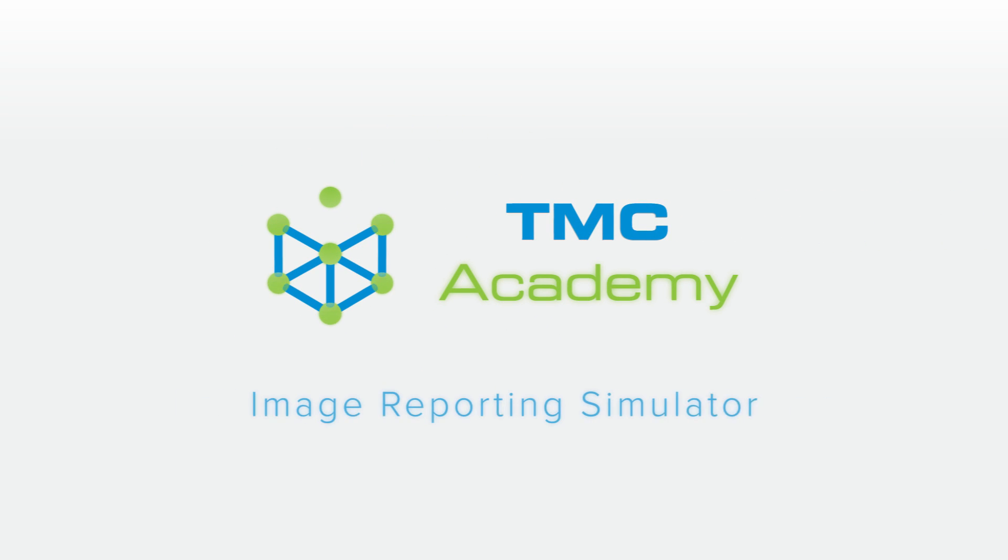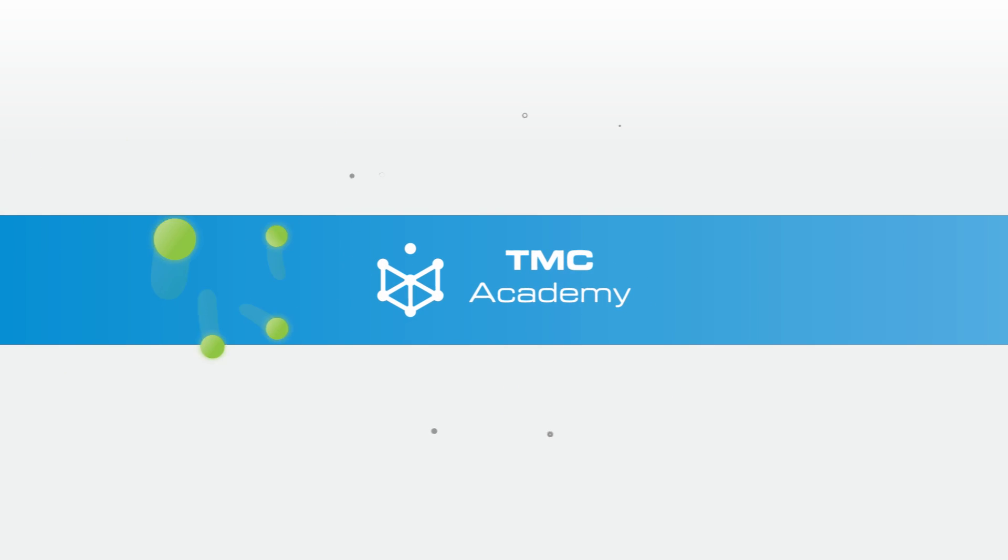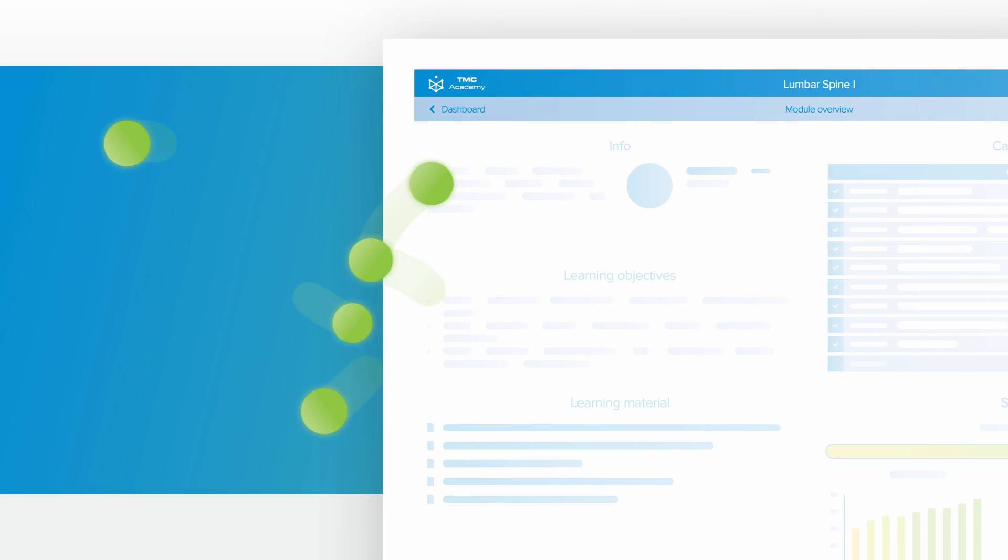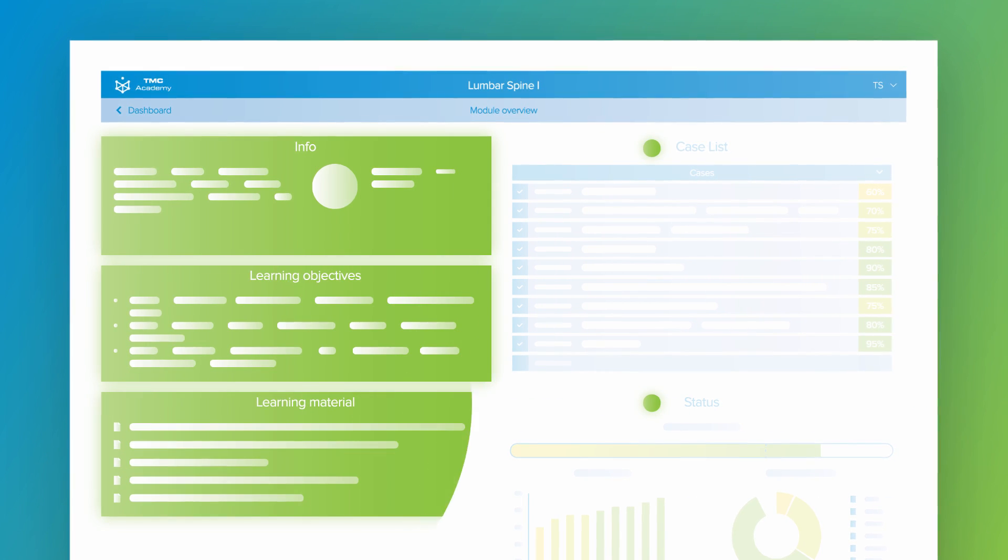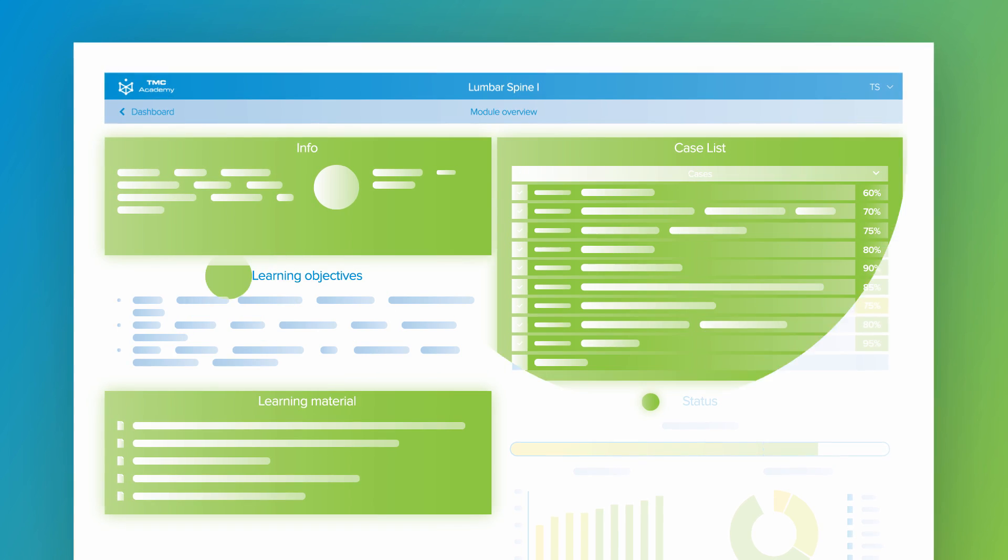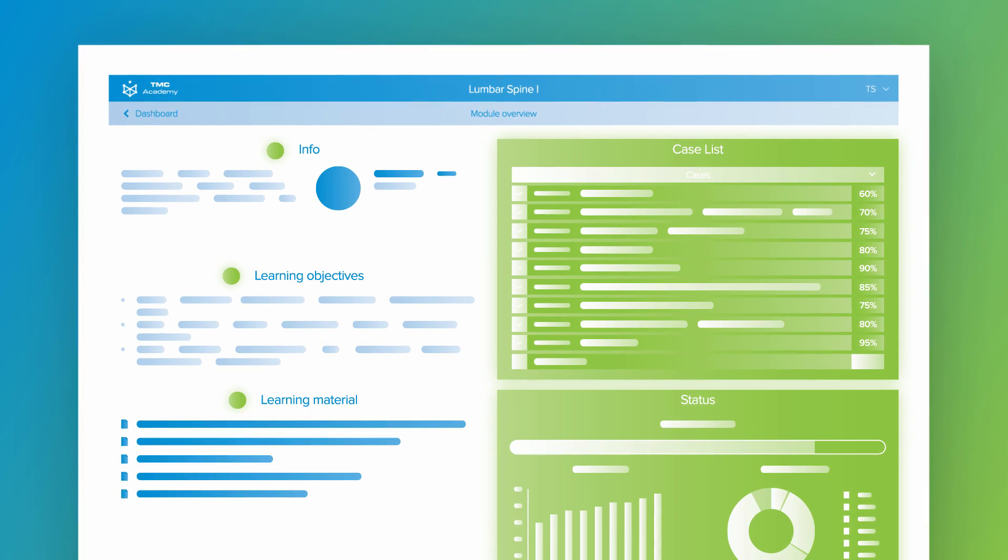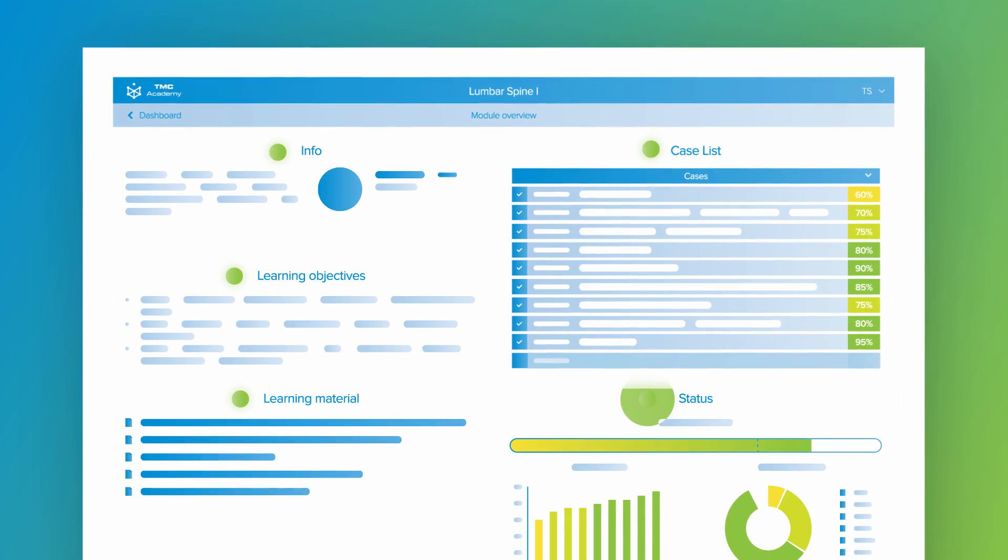TMC Academy's Image Reporting Simulator offers specialized modules which combine objectives and insights with applied practice on real-world cases.